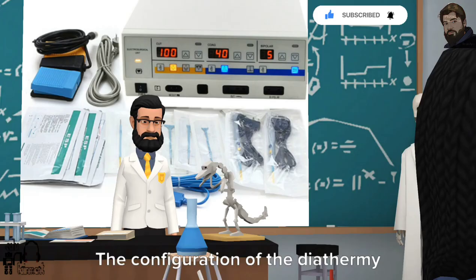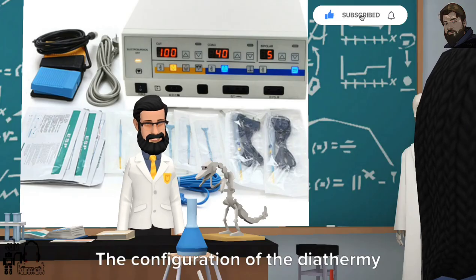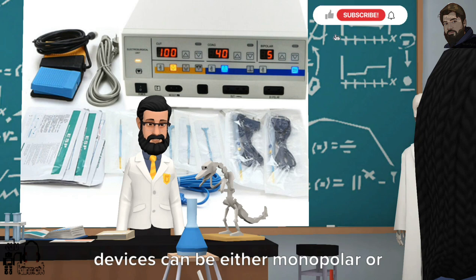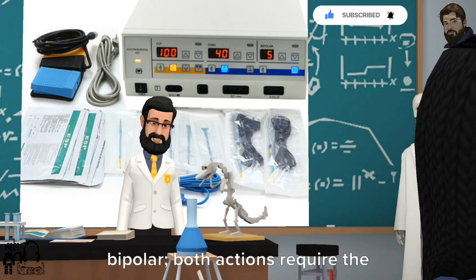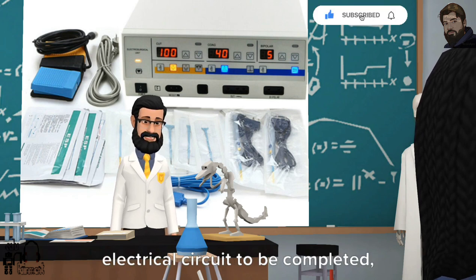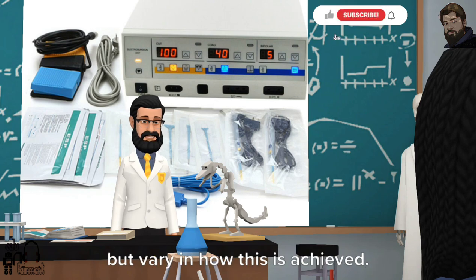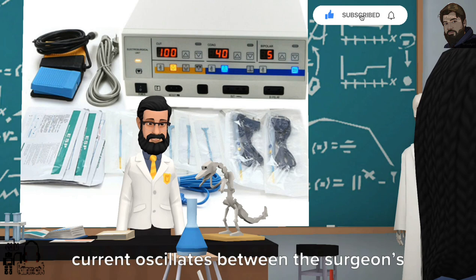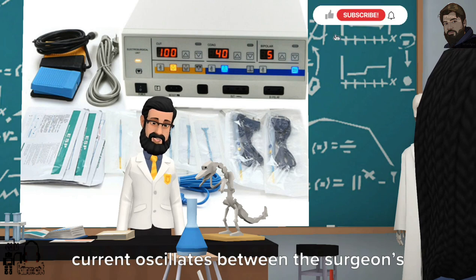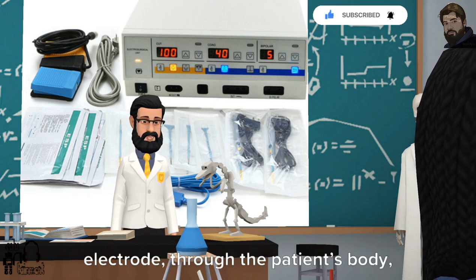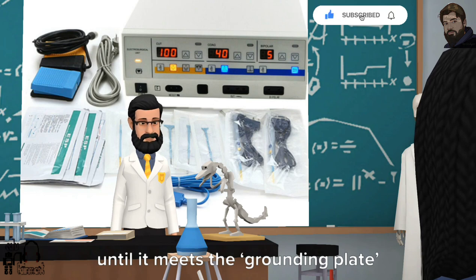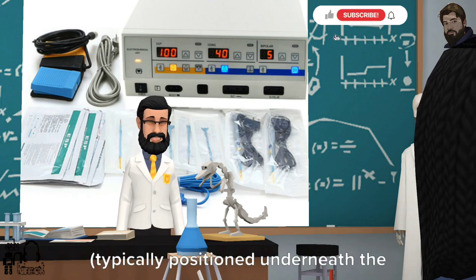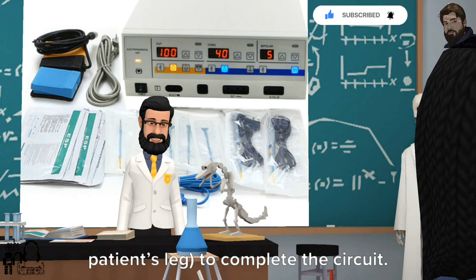What is monopolar? The configuration of the diathermy devices can be either monopolar or bipolar. Both actions require the electrical circuit to be completed, but vary in how this is achieved. In monopolar action, the electrical current oscillates between the surgeon's electrode, through the patient's body, until it meets the grounding plate, typically positioned underneath the patient's leg, to complete the circuit.